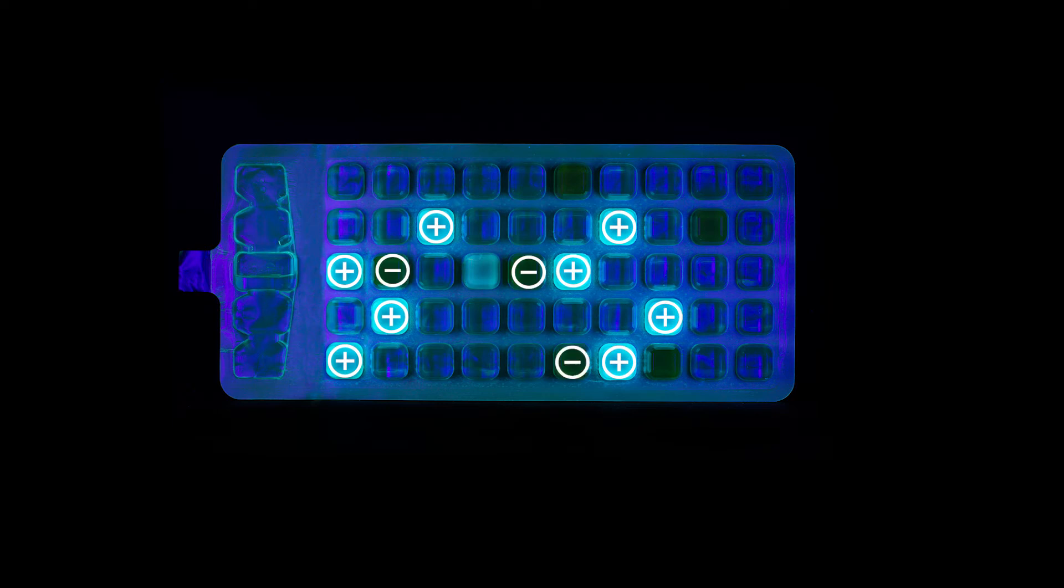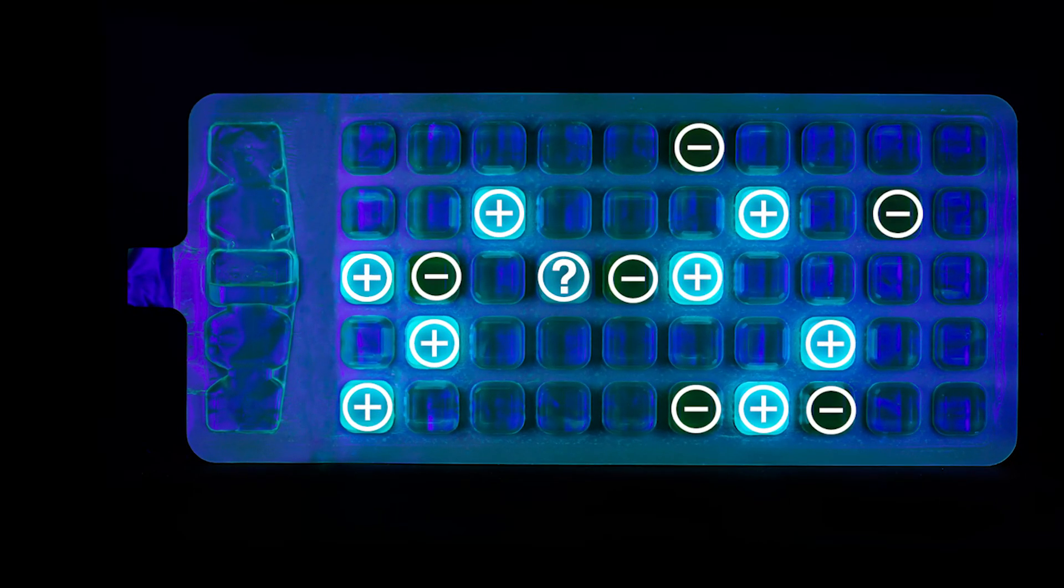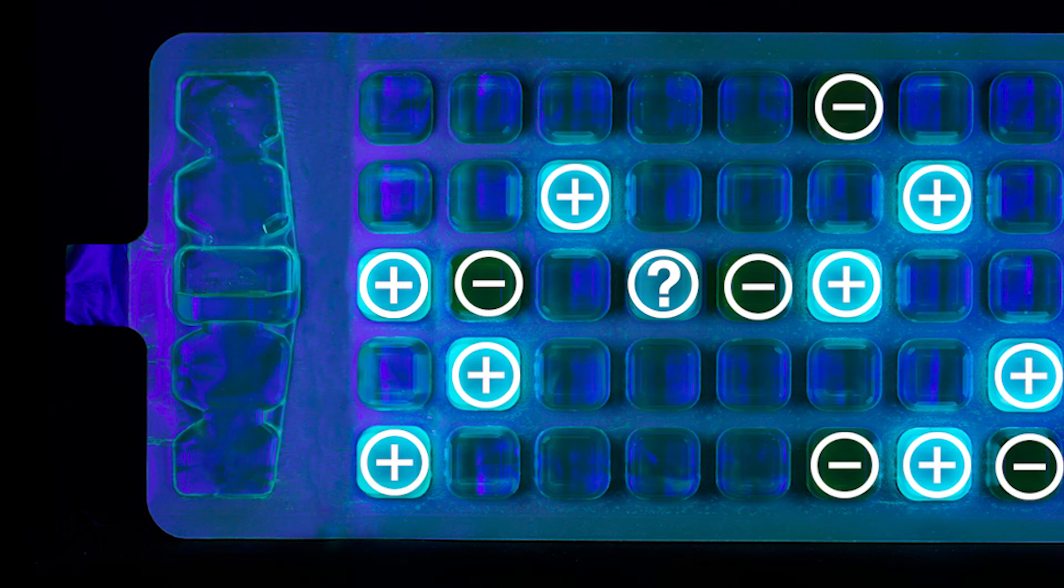If you are unsure whether a result is positive incubate the sample for up to an additional 4 hours, 28 hours in total to allow the colour and or the fluorescence to intensify.